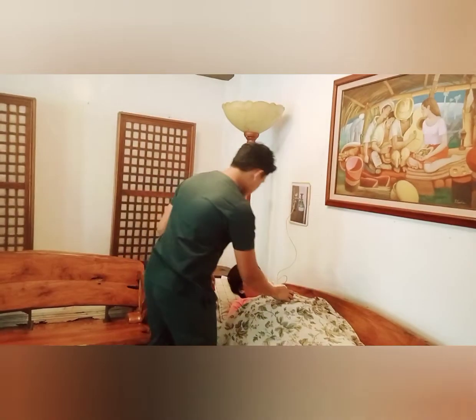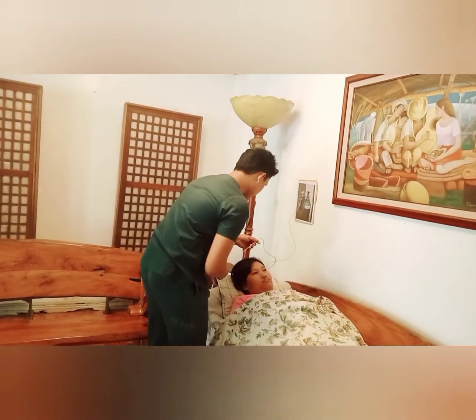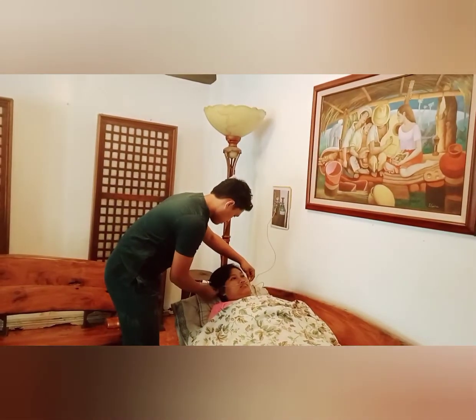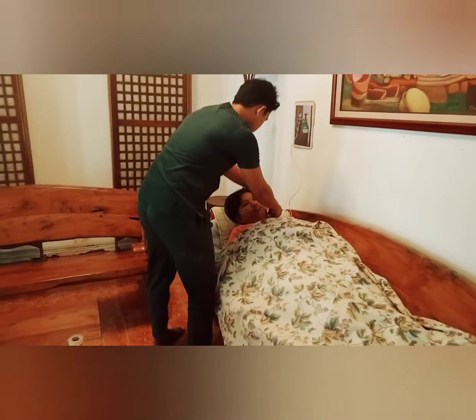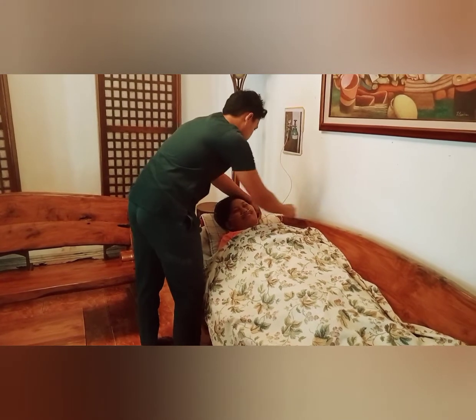And now, I'm going to insert the nasal cannula into the client's nostrils and adjust the tubing behind the ears, like this. And slide the plastic adapter to the client's chin until she is comfortable.